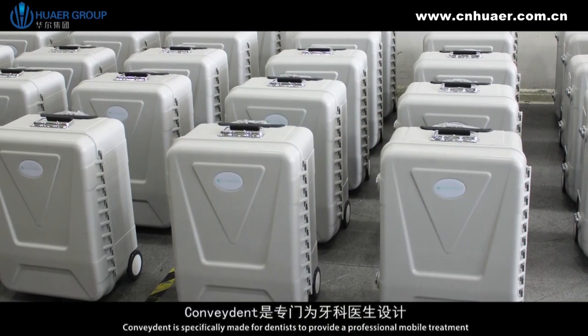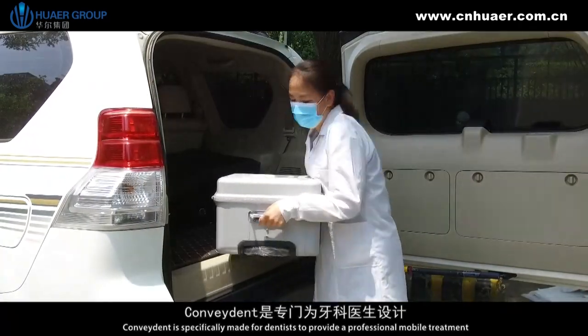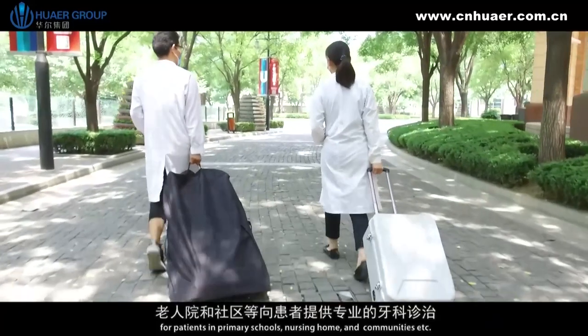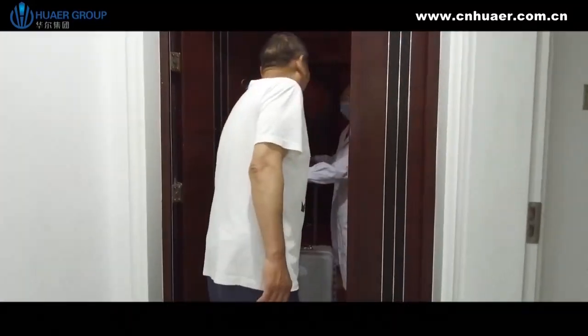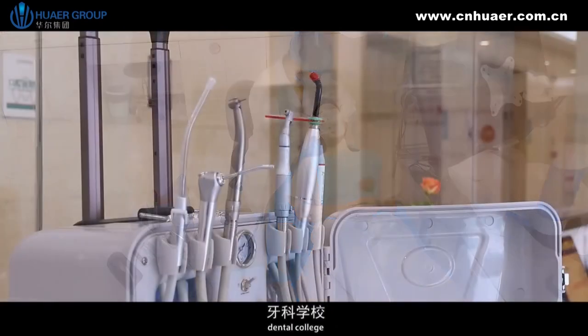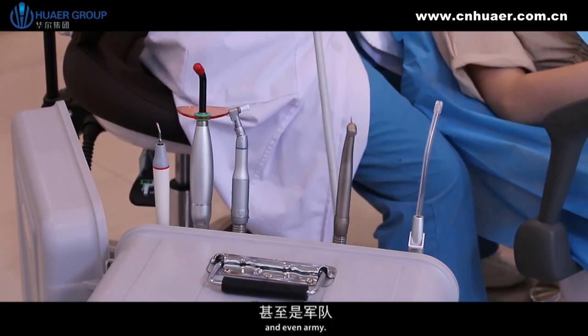Conveydent is specifically made for dentists to provide professional mobile treatment for patients in primary schools, nursing homes and communities. It is widely used for mobile dental clinics, dental colleges, veterinary hospitals, public health departments and even the army.